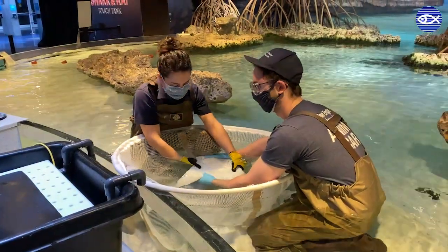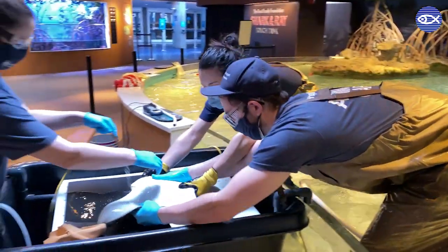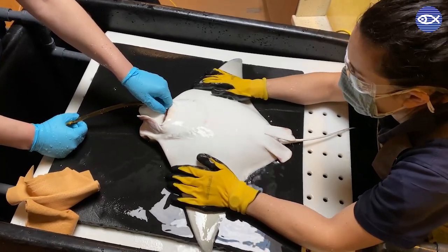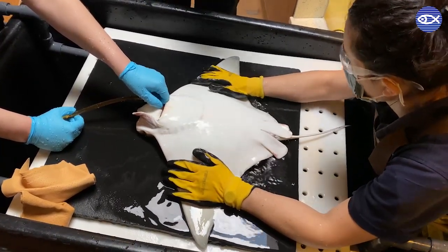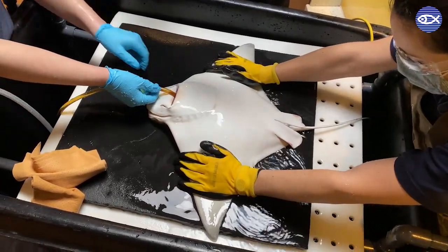Then the ray is placed on a padded exam table and a breathing tube attached to a water pump is placed in her mouth. A constant flow of water over the ray's gills allows her to breathe normally while out of the water for the exam and blood collection. Her skin is kept wet throughout the procedure as well to prevent it from drying out.